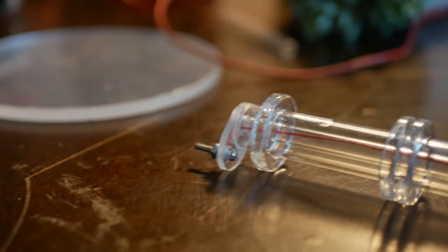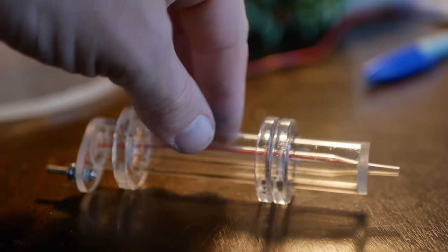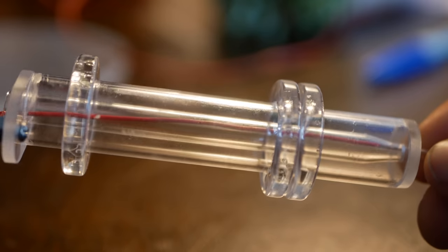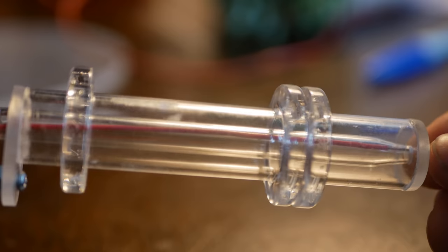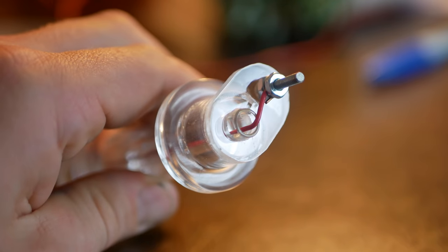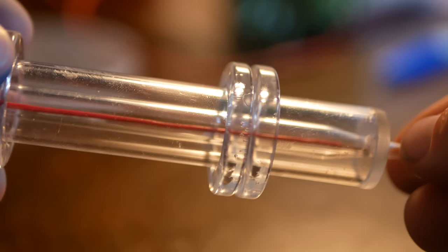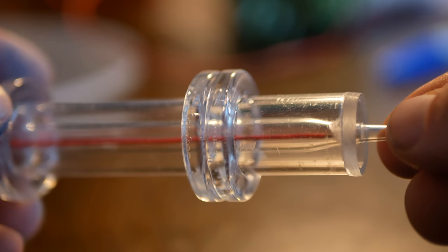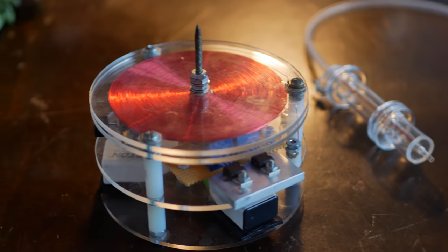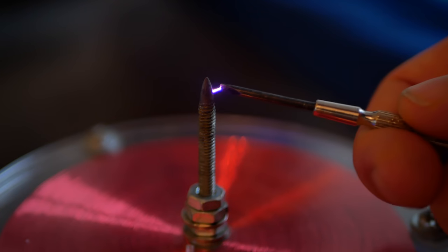So, no ground. The last design actually was working, but it was built super shoddy and it was practically falling apart, so I wanted to give it a makeover and give it a dash of acrylic. As you can see, the casing is an acrylic tube which holds a glass pipette centered down the middle. Running down the pipette is an electrode which stops about 12 millimeters from the nozzle, and the top has connections for both the high voltage and the helium gas. Around the tube are these insulating spacers which are supposed to reduce capacitive coupling to your hand, and they kind of work. It's fed gas from a large helium tank and electricity from that slayer coil, producing about 5,000 volts AC.